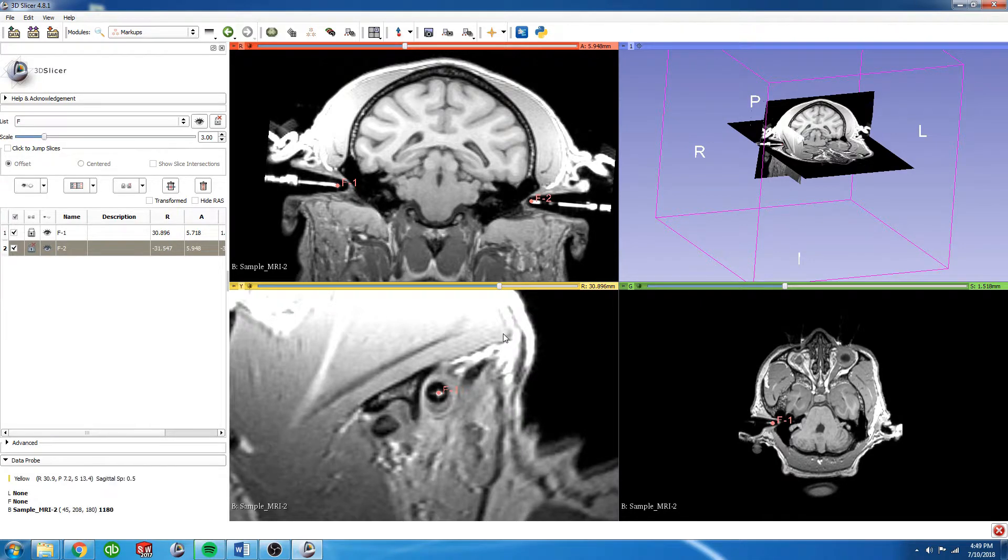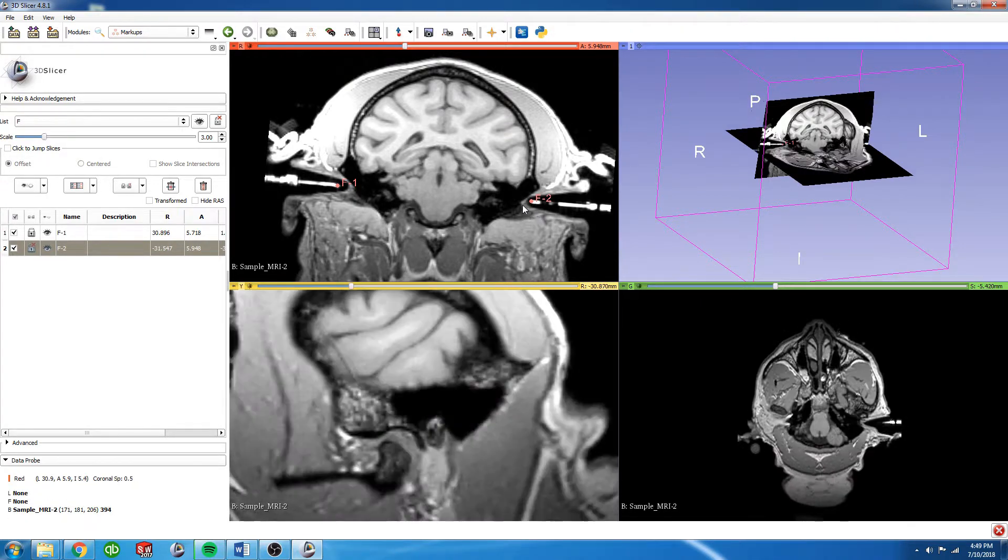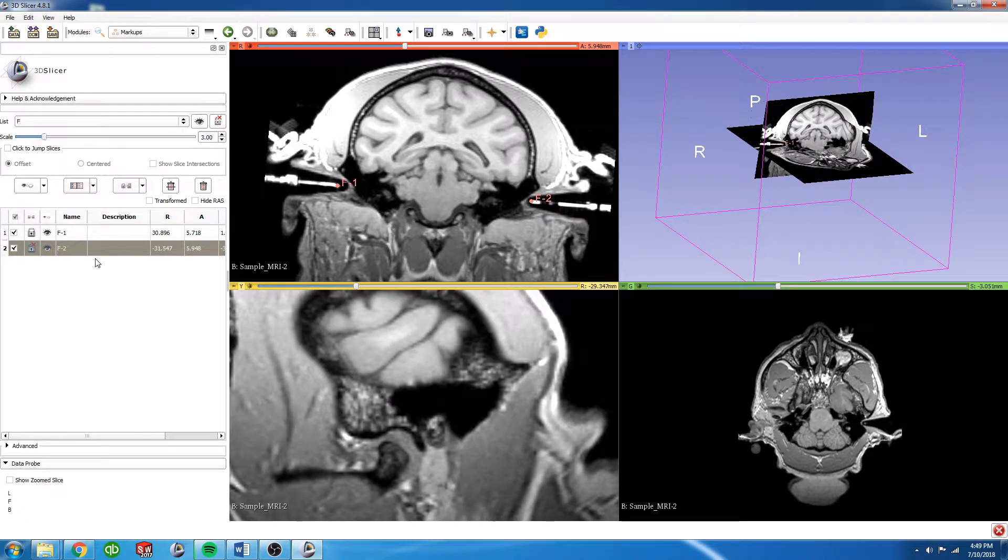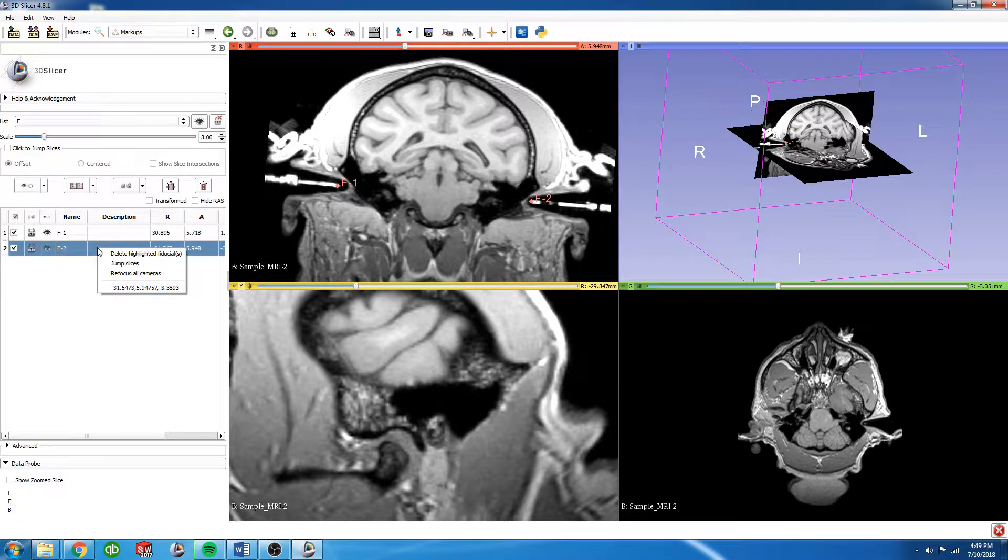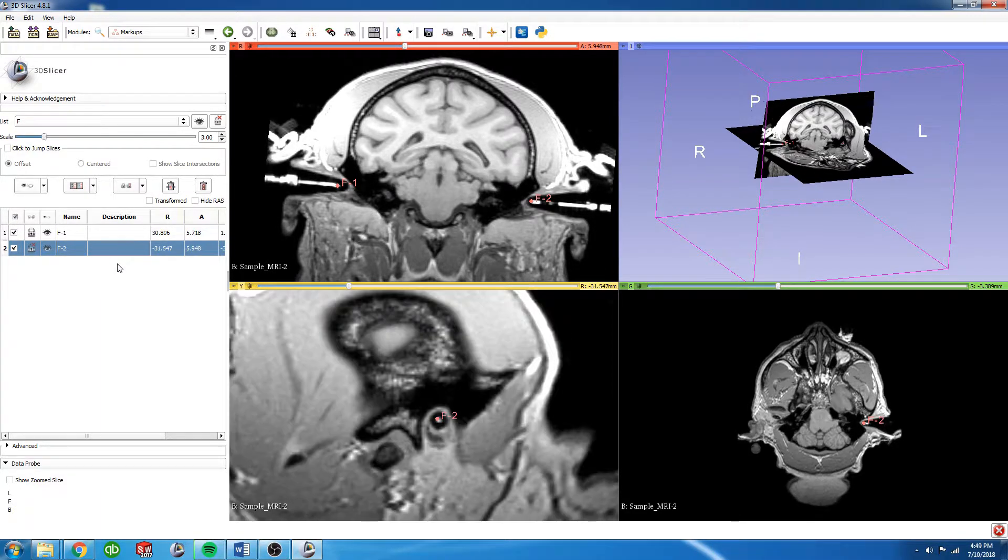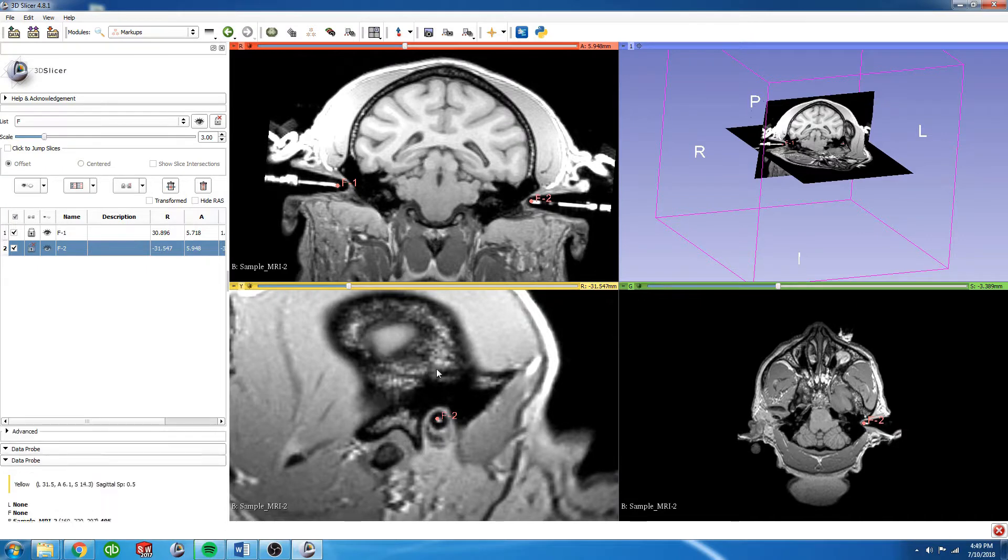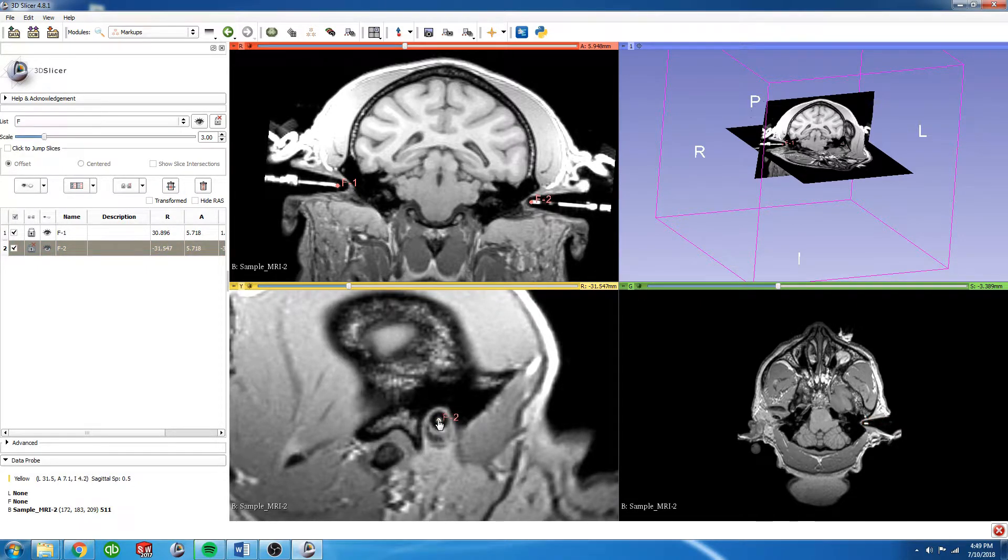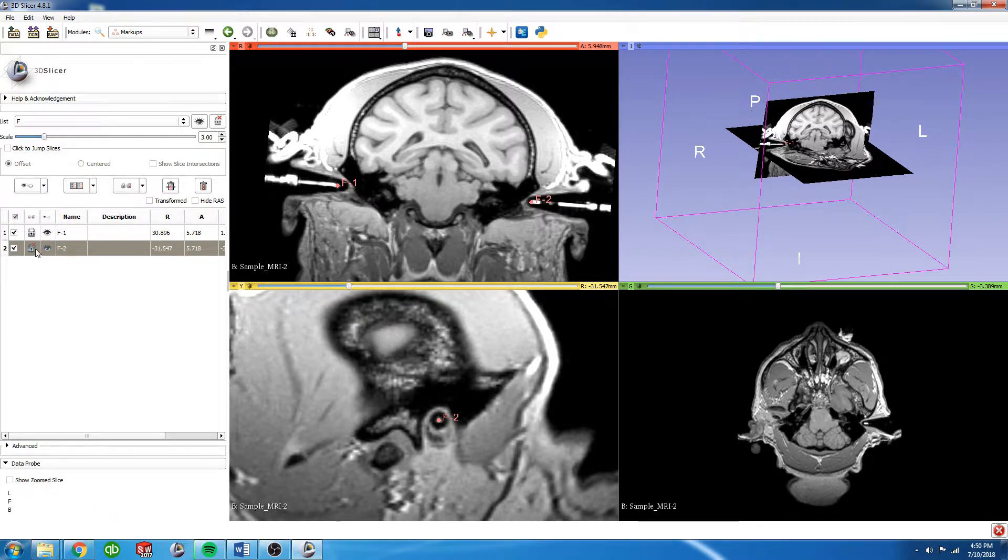We can again use the shift key to move around, or you can right-click on the fiducial that you want to jump to and click jump slices. This will adjust all three views to be centered around that fiducial. I'm just going to adjust it a little bit more there and again lock it.